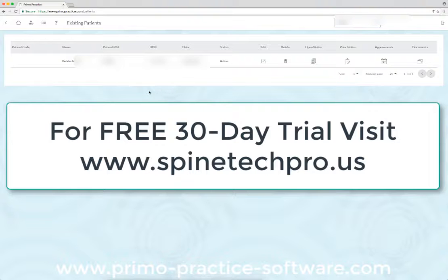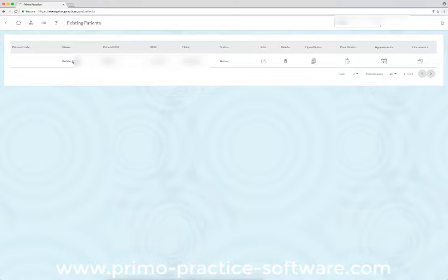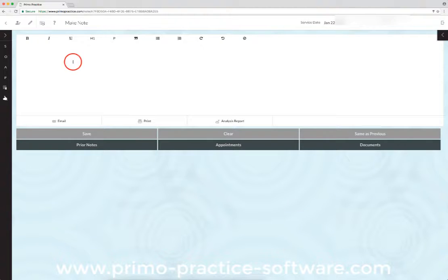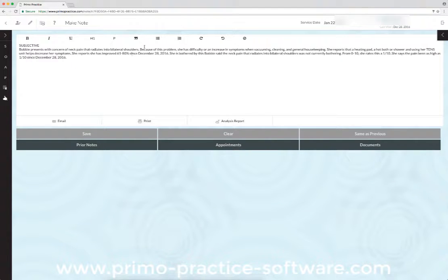So if you have a patient, in this case we're going to use this test patient Bobby, we'll open Bobby's chart. Here's her statement she's just filled out from the patient portal, and it's currently inserted.